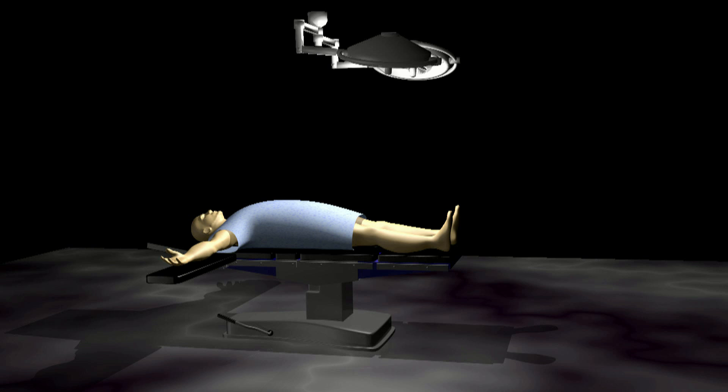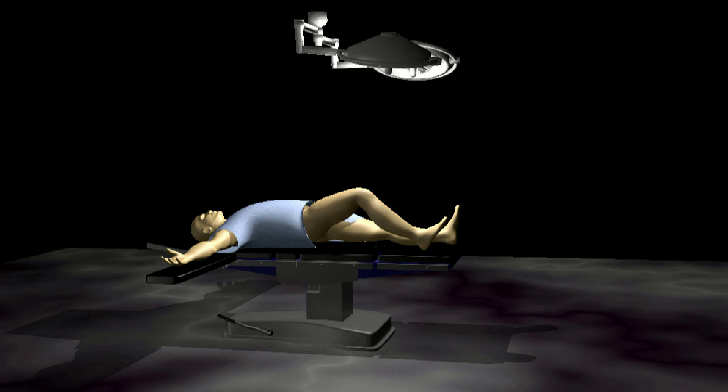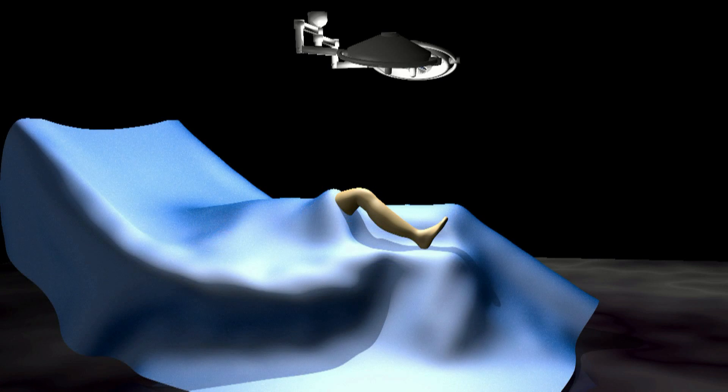The patient is positioned on the operating room table. Usually, general anesthesia is used, meaning that the patient is put completely to sleep. Other options are available, including a spinal block. Once the patient is asleep, the knee is thoroughly cleansed and sterilized. Sterile drapes are placed carefully around the knee to protect against contamination.